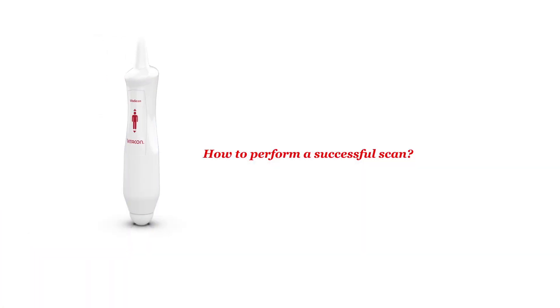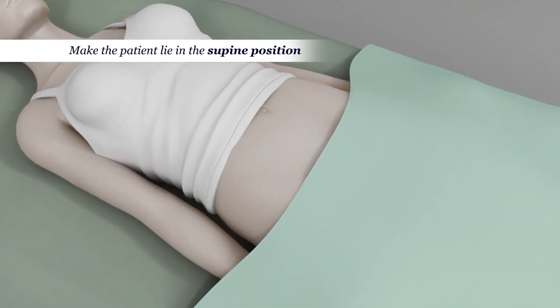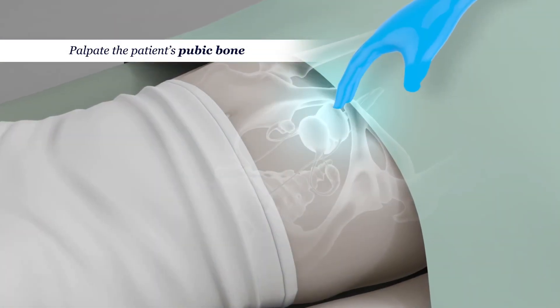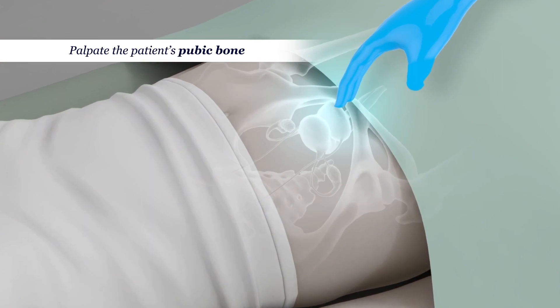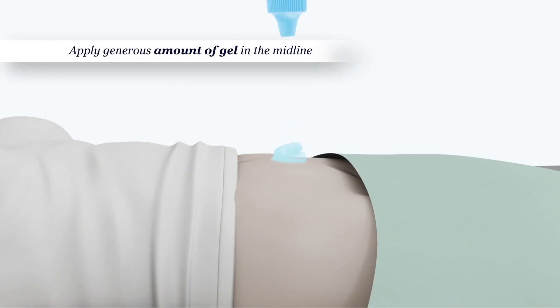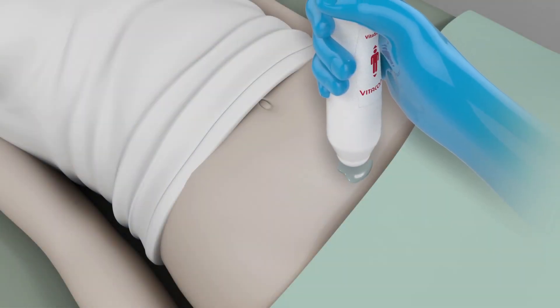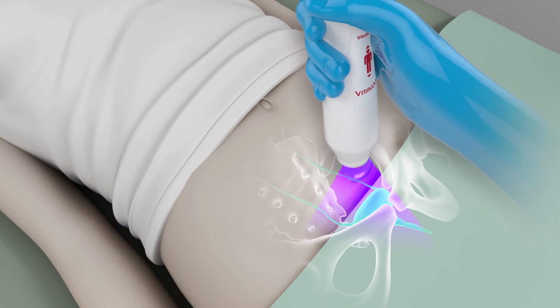How to perform a successful scan. Make the patient lie in the supine position. Palpate the patient's pubic bone. Apply generous amounts of gel in the midline, about 3 to 4 centimeters above the pubic bone. Place the probe on the gel and angle the probe toward the pelvic floor.